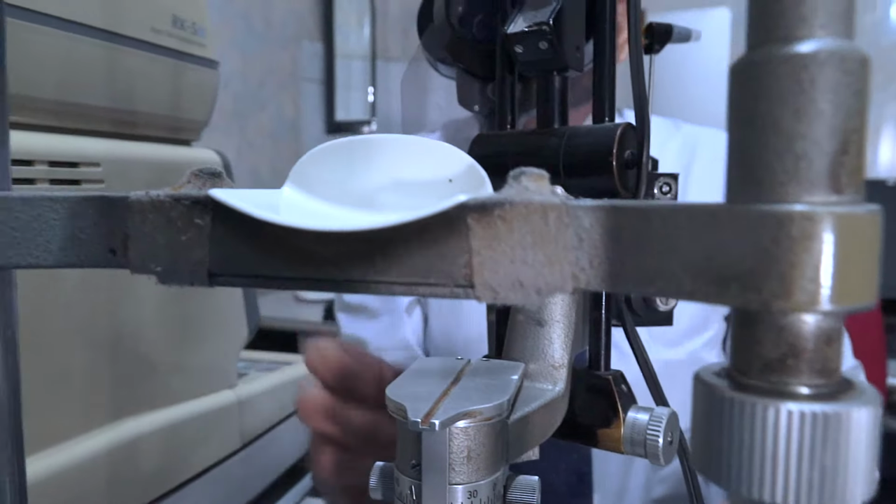This prism has an area which applanates the cornea, and then we can see with this slit lamp through these prisms, and they will show two broken half circles, and when these circles coincide with each other, we will show it in the slide.